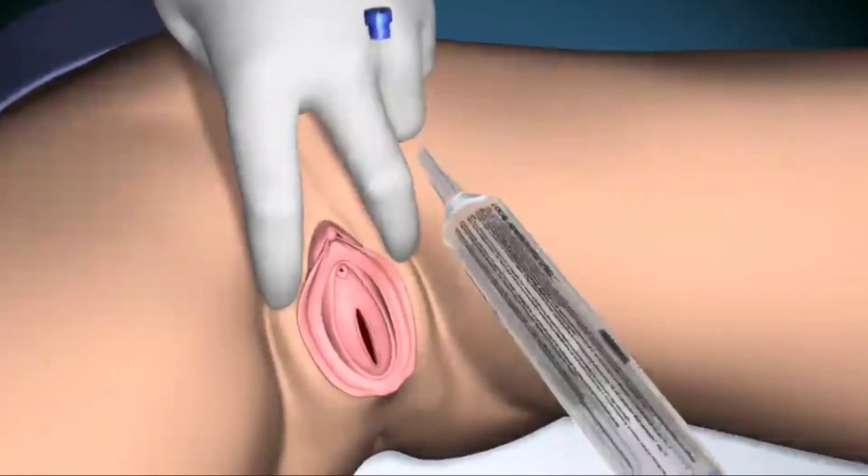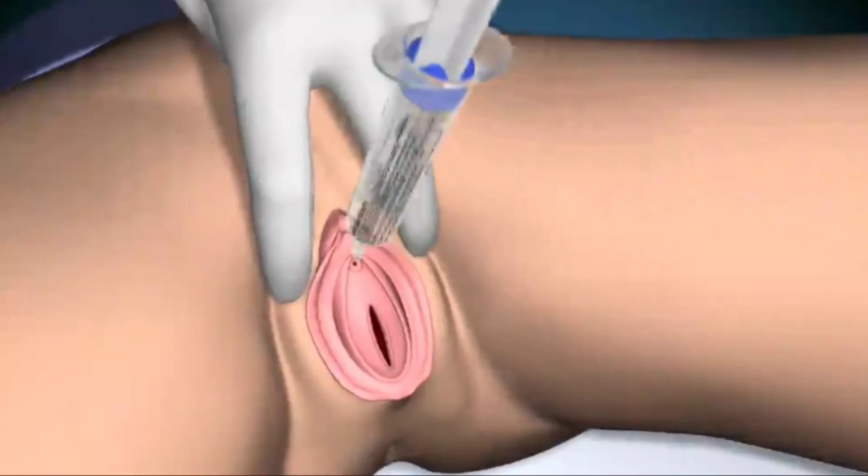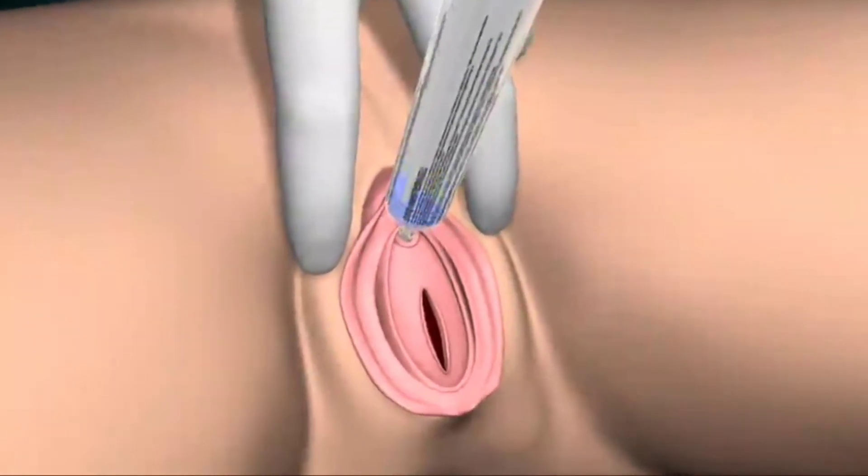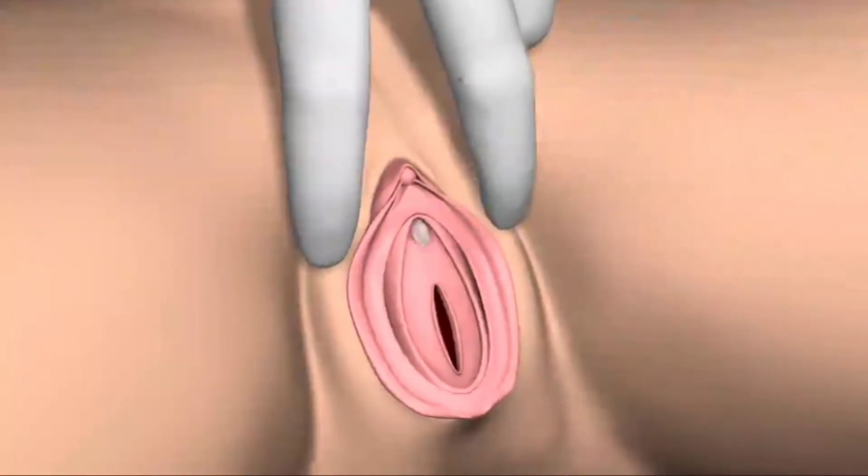With the right hand, take the cap off the lignocaine gel and gently insert the tip of the syringe into the urethral meatus. Then expel the contents into the urethra.